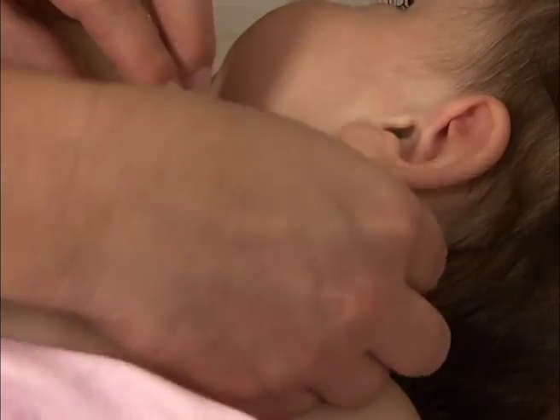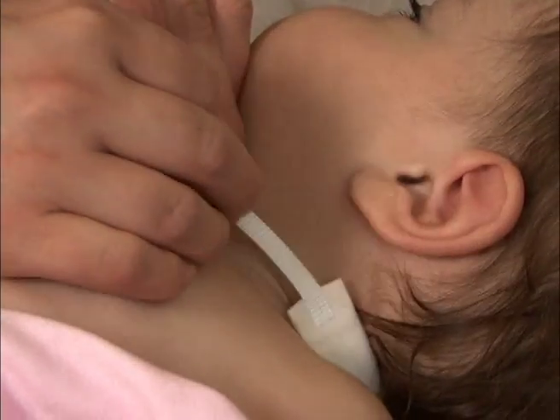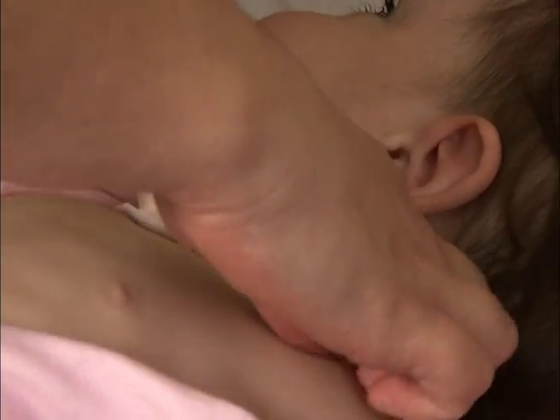Now you can attach the new trach tie and you're done! Most children get very used to this daily routine and will even work with you by moving his or her head as needed.